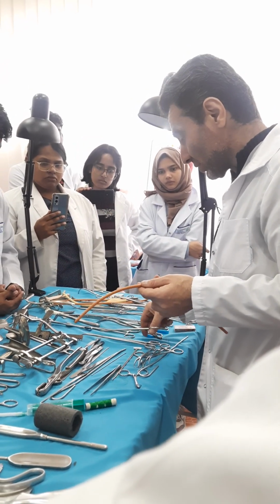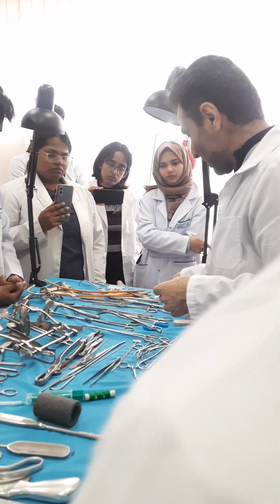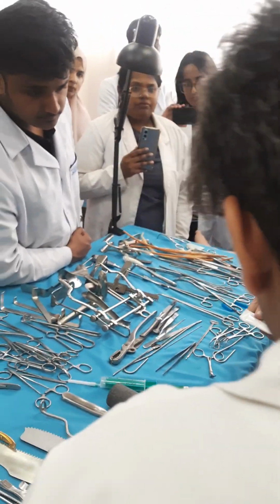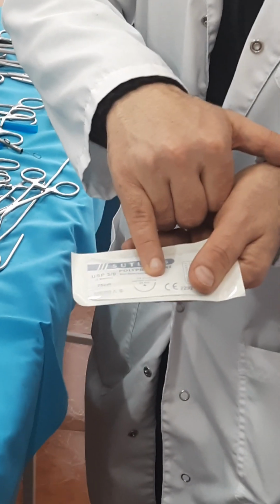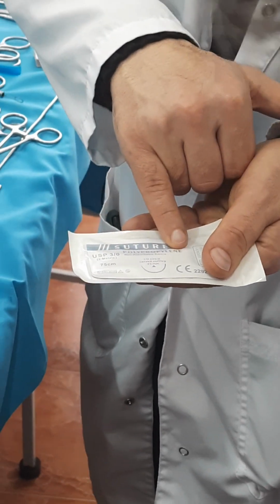Finally, threads. Of course, thread is not an instrument, it is material. And by the way, nowadays, when you take the atraumatic needle, all the information is written. For example, you can see 1/2 of the circle, curved cutting, length 23 millimeters. About the thread, it is written polypropylene, non-absorbable suture.